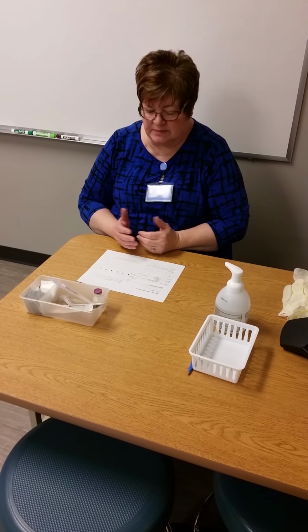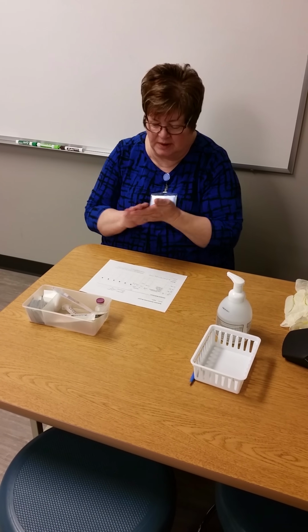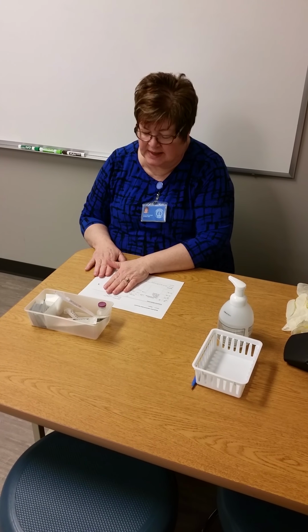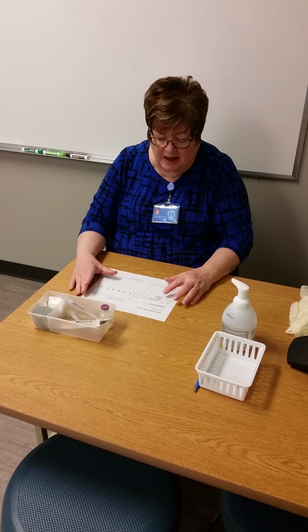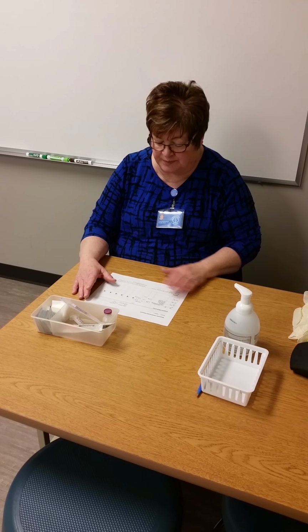Okay, today we're giving some medications, intradermal injection to Casey Banks. So I walk into my medication room, I do hand hygiene, I open up my medication cart, and I look at my MAR, and we need Casey Banks 10-2-1965, has an allergy to aspirin. Casey is needing Tubersol, which does not contain aspirin, and sterile water, which does not contain aspirin.